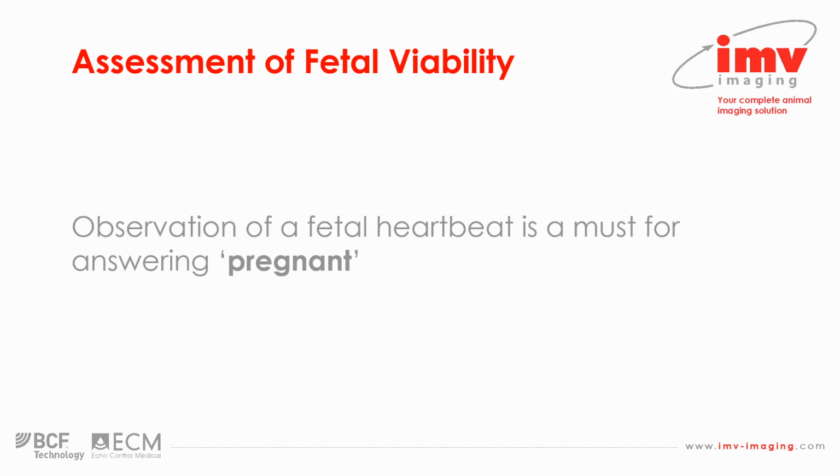I think to say pregnant without seeing a fetal heartbeat, unless you're much later on in pregnancy and gestation, and you have a calf that's over a pelvic brim and you've got huge cotyledons and so on, that's obviously a different matter. But if you are assessing fetal viability in early pregnancy detection, as is going to be most relevant with ultrasonography, then you really should be considering observation of a fetal heartbeat as mandatory.